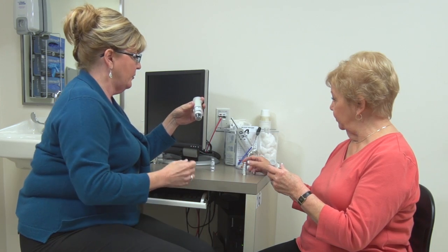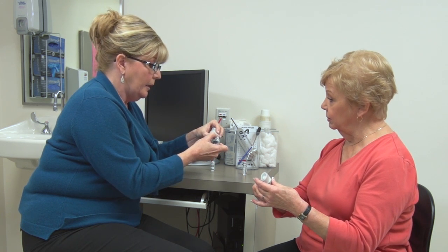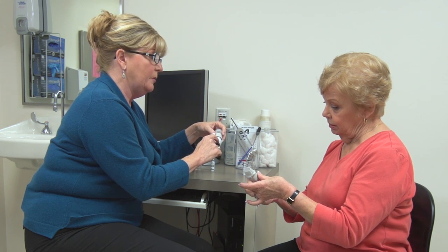The first thing needed is to load the medication into the device and prime it before taking a dose. To begin, hold the top portion and push the little gray lever to slide the plastic cover off. On the label there is a place to put a discard date, which should be three months from today. It's important for patients to add three months to the date they open the medication and write this discard date on the Respimat device.